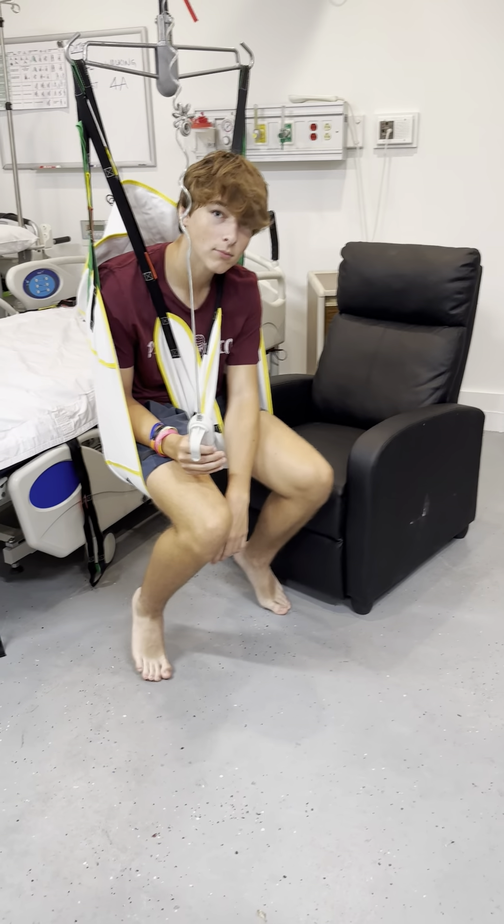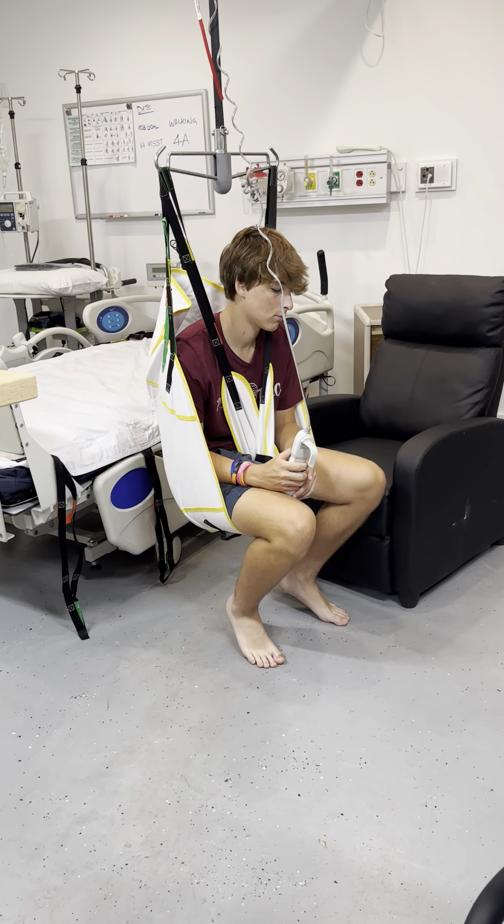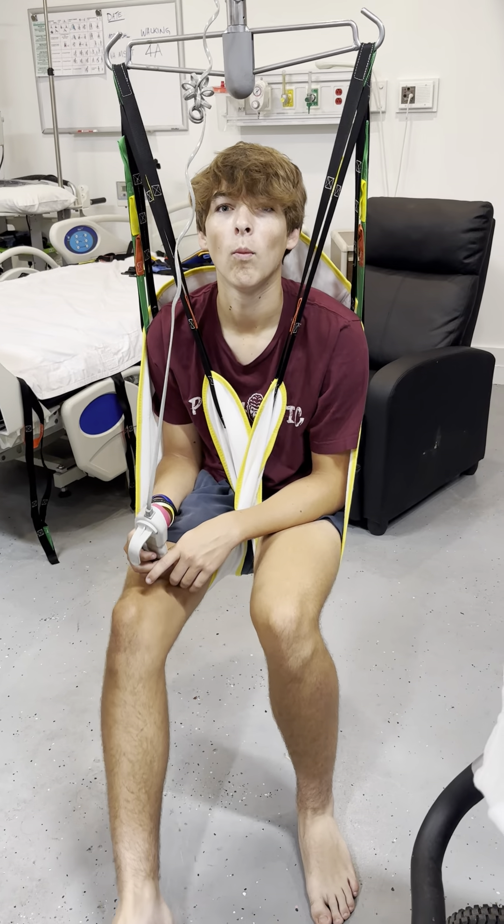Lower yourself down and walk on your feet, almost like you're in a wheelchair. Just walk yourself around. Walk yourself back to the chair.